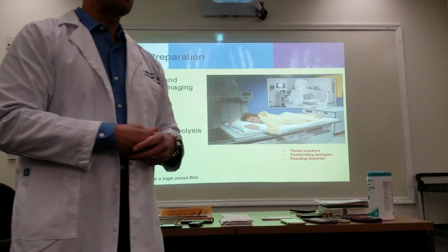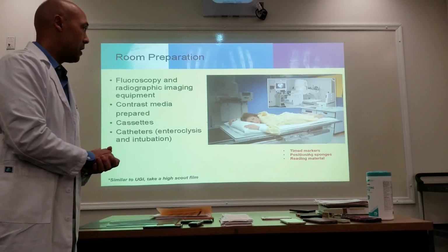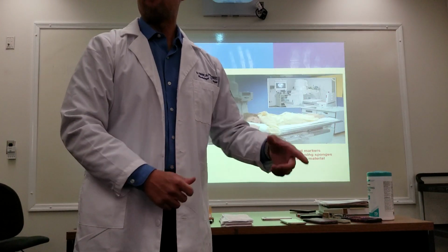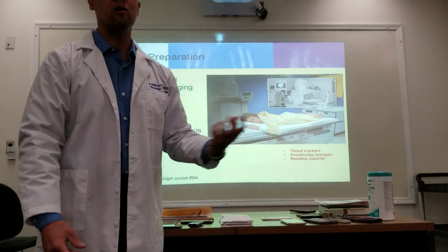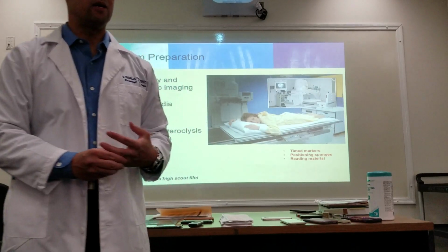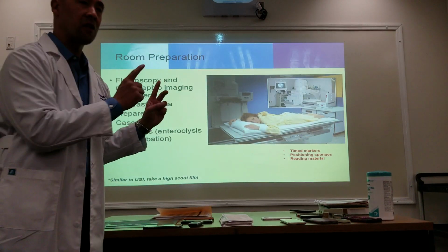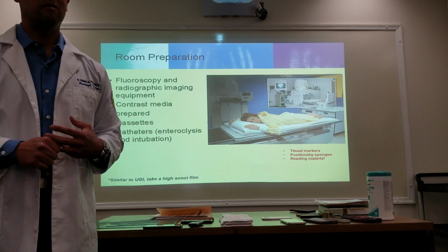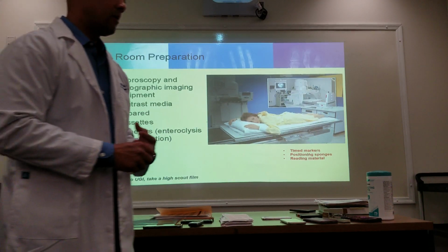And what they mean by go ahead and proceed is go ahead and get them on the table or on the standing version of the table, and then get them ready, go up on the table, give them the cup of their contrast, and then you call the radiologist in to perform their esophagram. Okay? But all that is done before you call the doctor in to perform his study. Okay? Now, that's the esophagram.